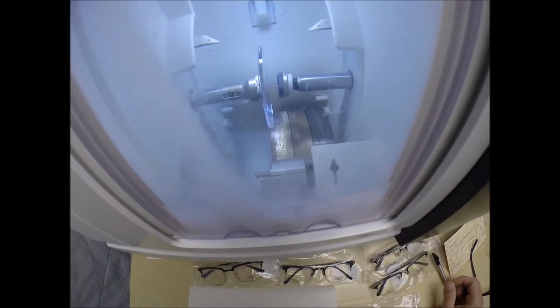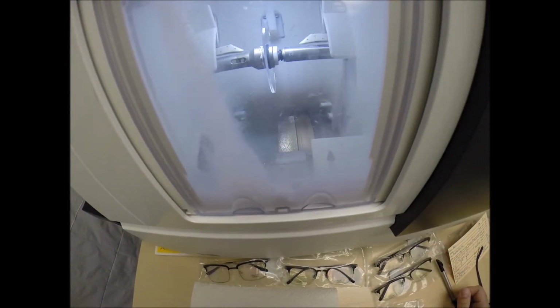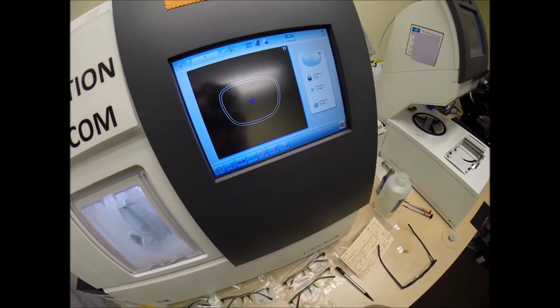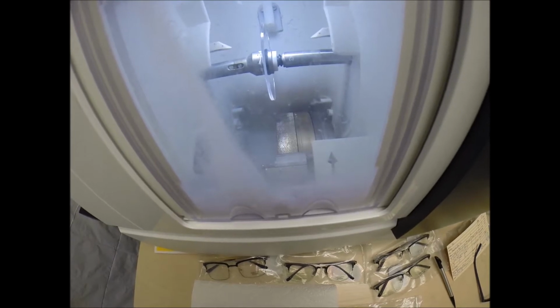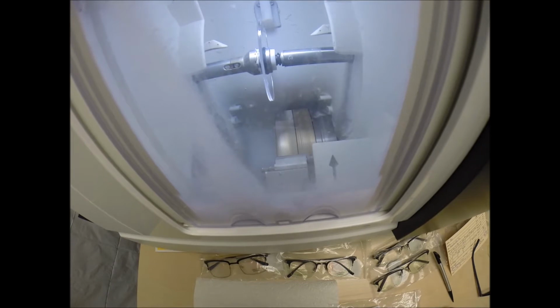The door closes, the clamp shuts, and then the lens is going to be traced by 2 white styluses, making sure that it's large enough to fit into the frame. You can see as it's going around tracing the shape of the lens that will fit into the frame. And the old carpenter saying, measure twice, cut once. It's measuring the thickness of the lens at every point to know exactly precisely where to place the bevel so you have the least amount of edge thickness showing.